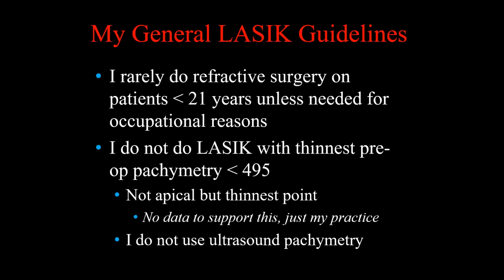I don't do LASIK, or you never say never, but in general, with a thinnest pachymetry below 495, and that's a thinnest reading, not an apical reading. There is absolutely no data to support this. It's just what my practice is. And I've not used an ultrasound pachymeter in probably eight years. I completely use the thinnest reading off the Pentacam.